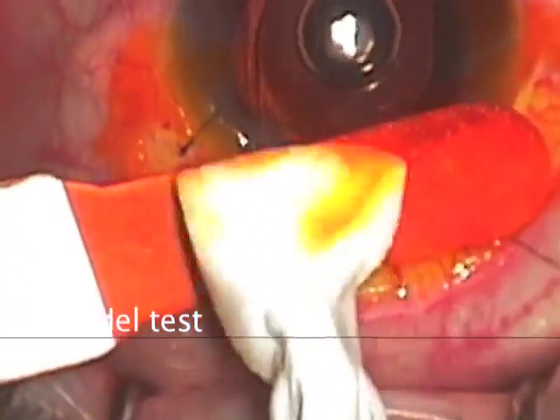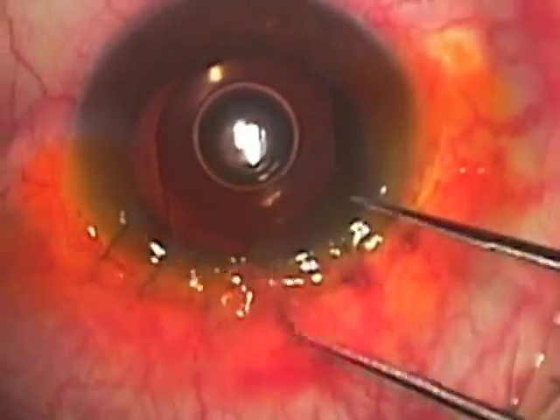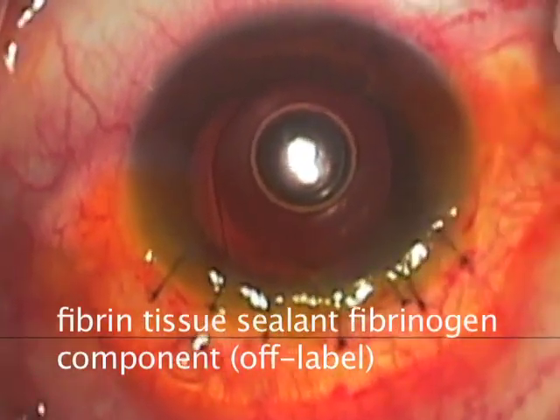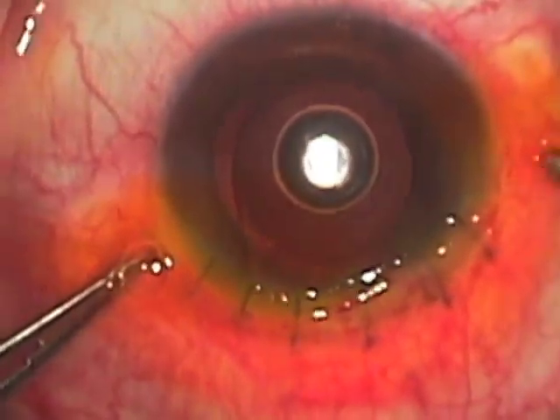The remaining sutures are placed and a Seidel test can then confirm that we have a completely sealed incision, or else additional sutures are placed. Finally, we pull forward the remaining conjunctiva and use just the fibrinogen component of fibrin tissue sealant to secure it to the limbus over the wound.